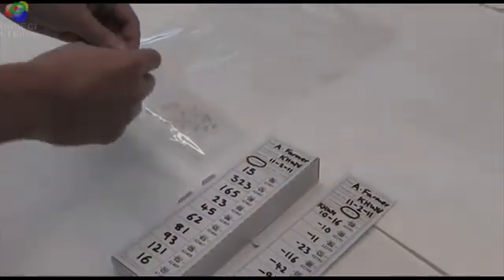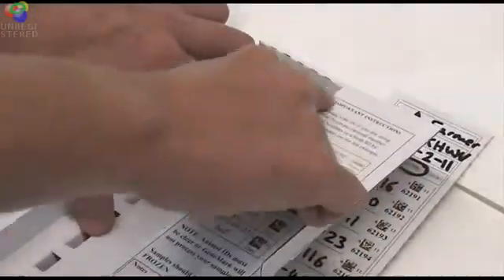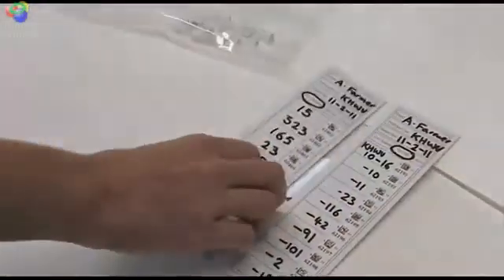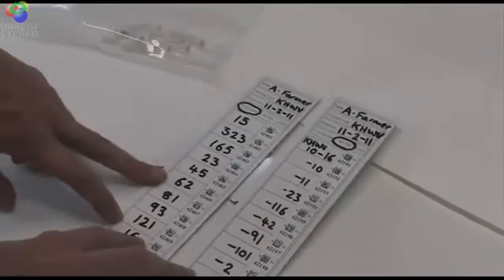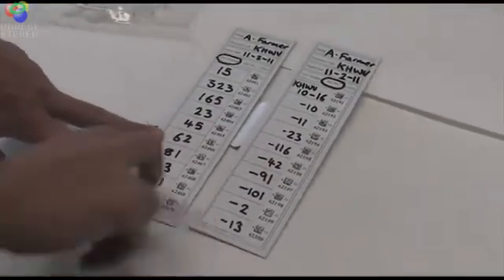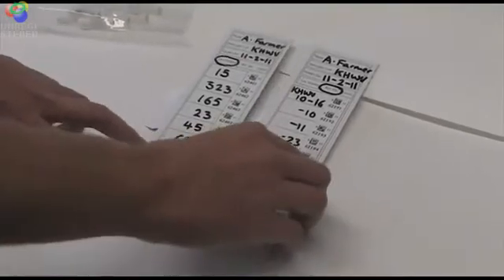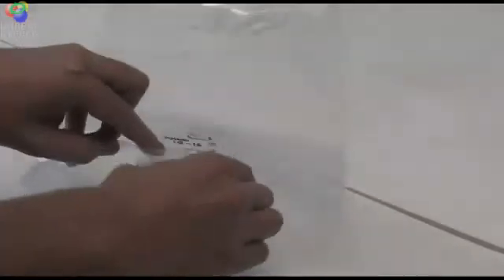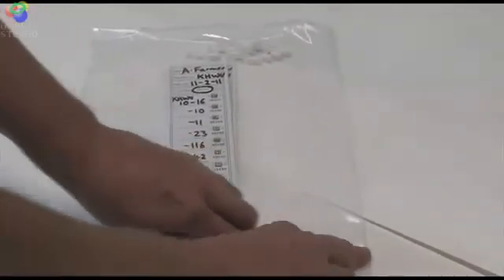As you complete your samples, you can place them into a zip lock bag ready to return to Genemark. The top of these boxes can be removed by tearing along the perforated line. These two box lids now form submission cards. They can be placed with your samples in the plastic bag, sealed up and returned to Genemark.